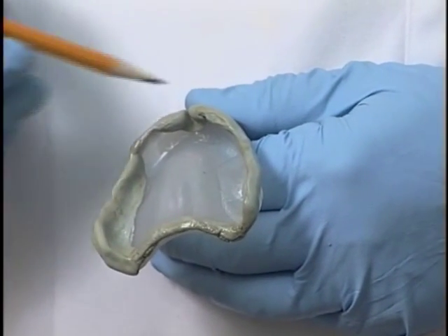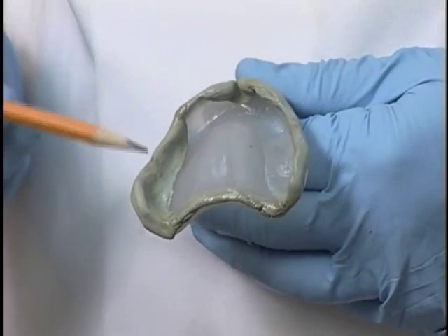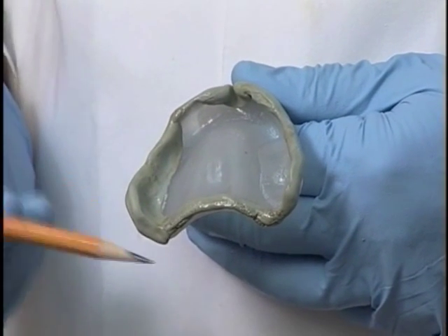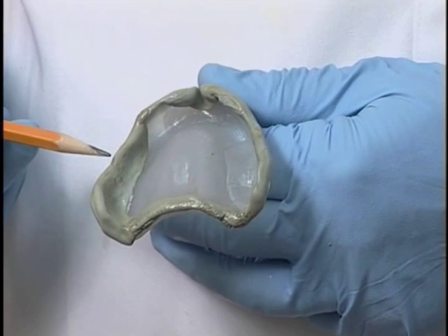Now that we have finished our border molding, we can examine it and see that we have picked up all of the anatomy all the way around. Good border molding will always show that the periphery is nice and rounded without tray showing through. If it comes out knife edge, that means that the material is short.